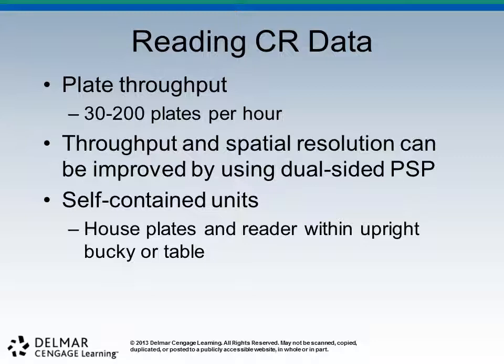Anyway, I don't know if anybody's using these upright units. I haven't seen any of these, but they would put the image plate reader right inside the X-ray machine. I've just never seen one of those, but it's possible. I have seen a film processor made by Picker, the Picker Rapido, that was stuck at the end of the X-ray table, but I haven't seen one of these here. Anyway, it's possible, and it'd certainly be cool.